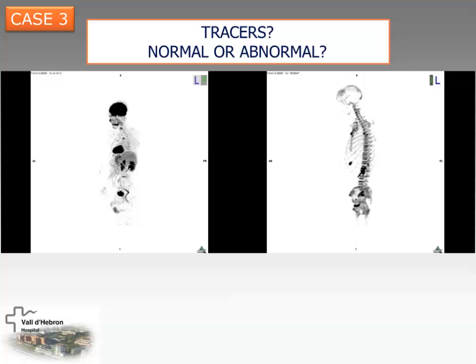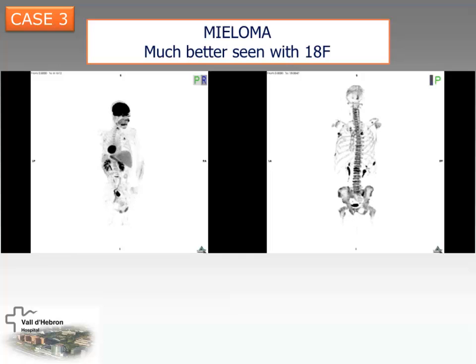In which oncologic disease can we have a normal bone scan with a lot of bone metastases? Myeloma. Okay.